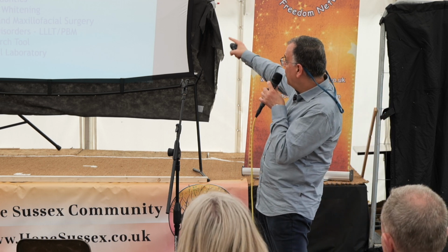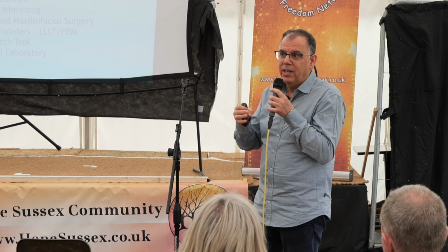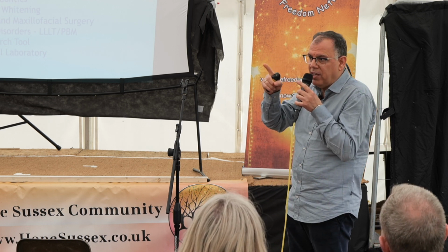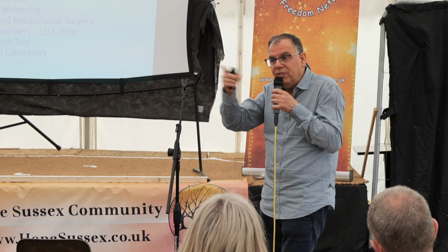And I will come back a little bit to the endodontic root canal treatments, because we said that people come to me asking for extraction. While if we have done the root canal treatment with laser application before, the possibility of taking this tooth out will be really diminished almost. Because the irradiation of laser is the only one that could be irradiated to the surrounding tissue of the root and inside the root, and could sterilize the lateral canals of dentin.